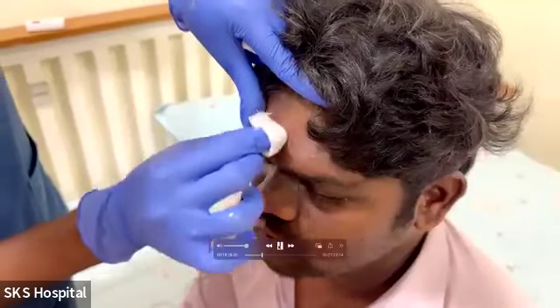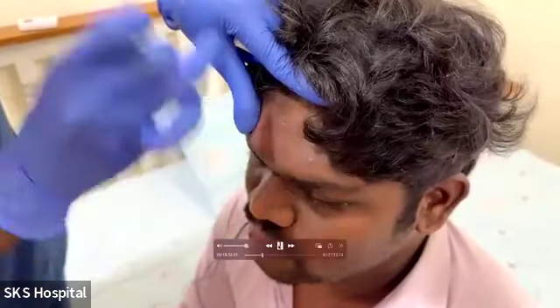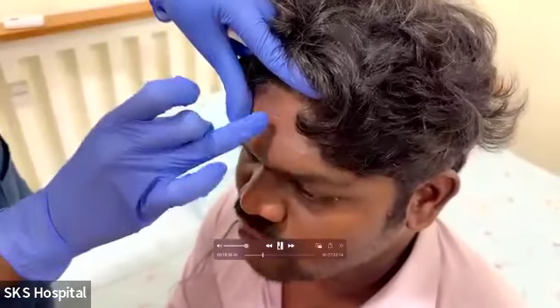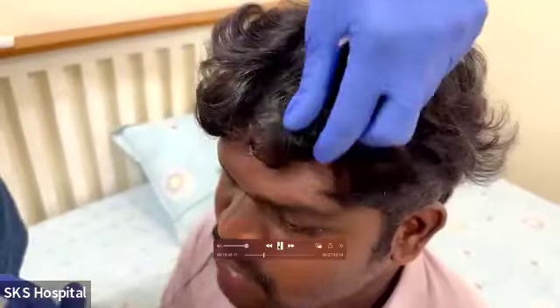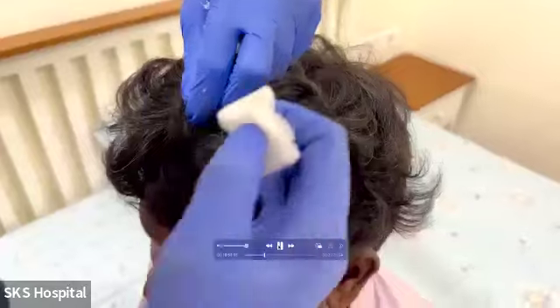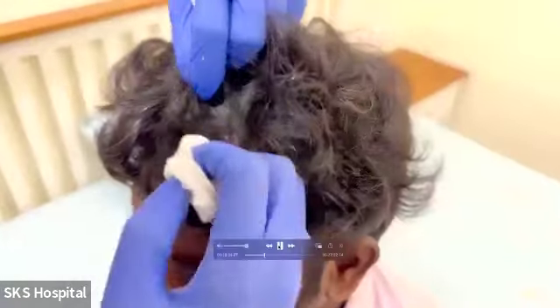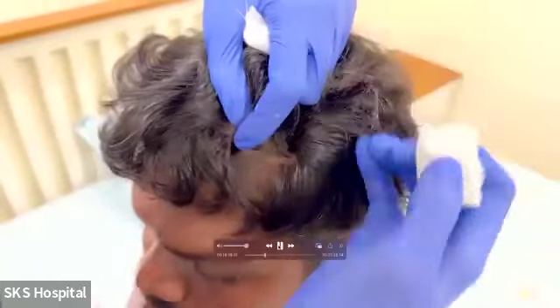Initially the skin is being prepared with a skin prep gel, which is very important because the skin's upper layer is scraped off and then the low impedance gel is pasted. This is very important so that the skin is prepared properly and the impedance is as low as possible to pick up EEG signals. Every point where you mark will be prepared with skin prep gel, and only then the low impedance gel will be used.